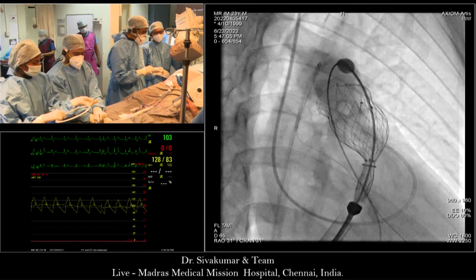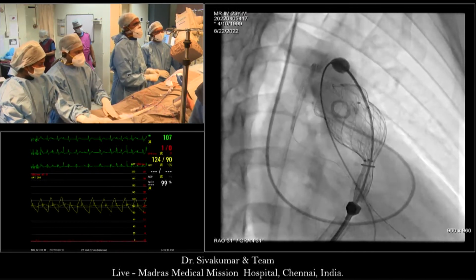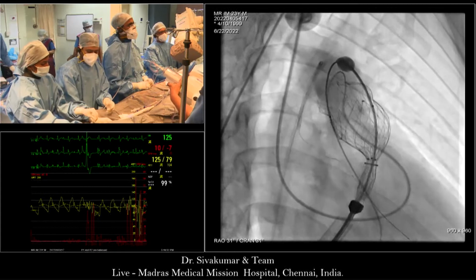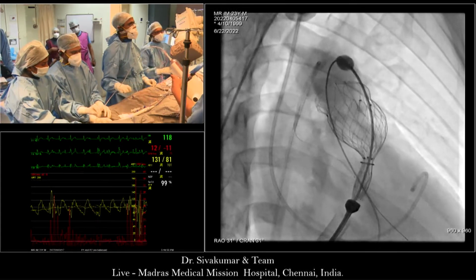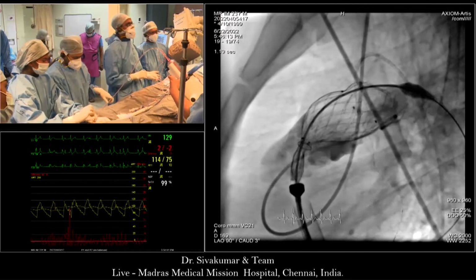Yeah, in my head, I haven't got a clear view of where the native valve is in relation to the proximal markers. So, I thought it was a bit lower and so it could come back. But we need to define that. Show the previous angiogram once again.